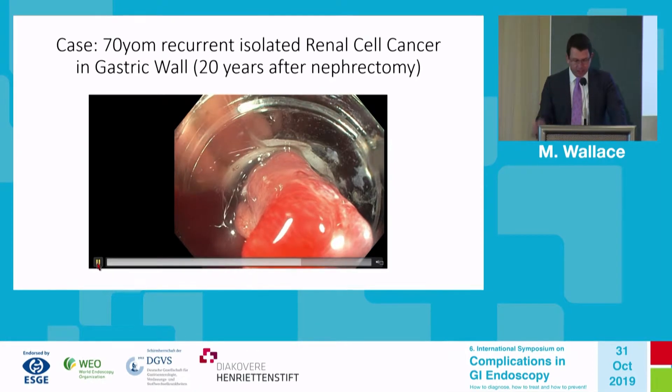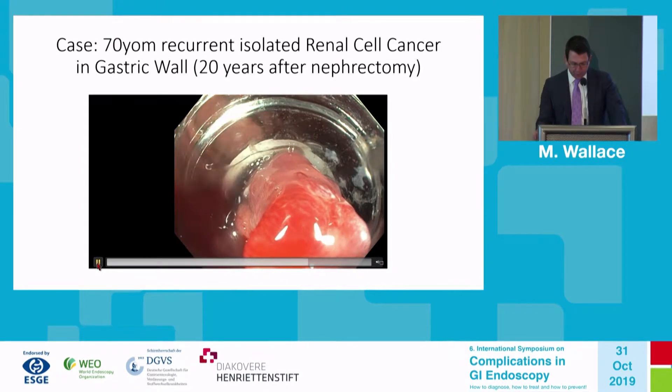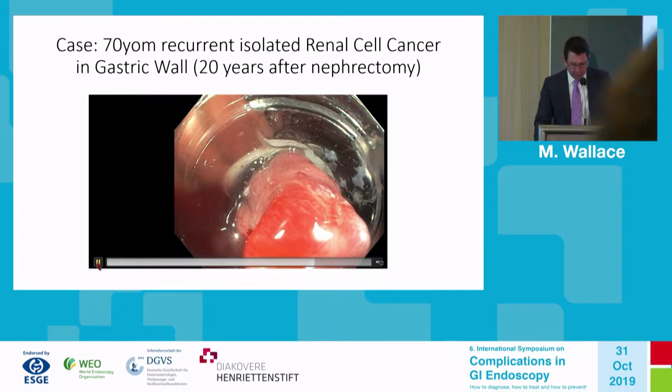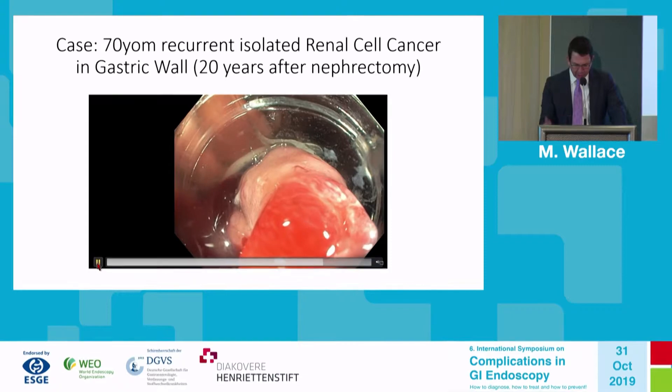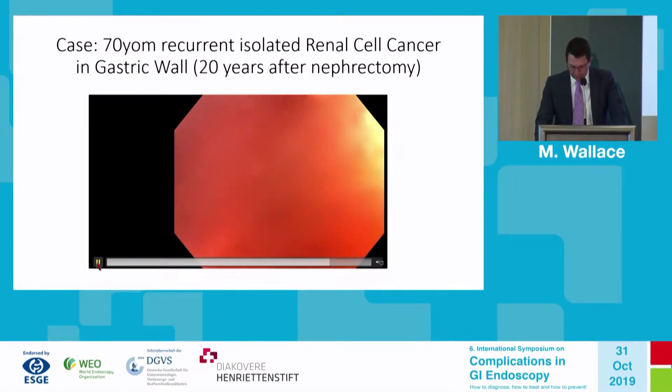We actually have a timeout-like procedure with the nurses. We all confirm that the clip is deployed fully, then close the snare and apply electrosurgical current. Now the lesion — we've cut through the lesion — and we'll discuss that in more detail in the subsequent lecture as to why that step is so important.